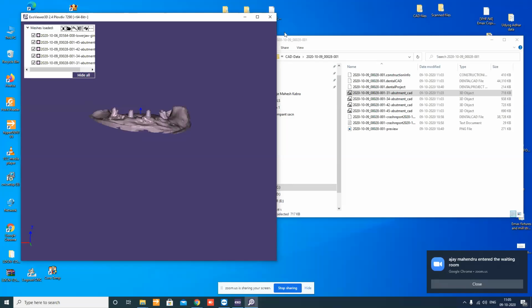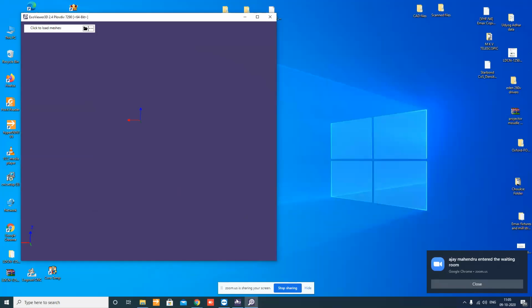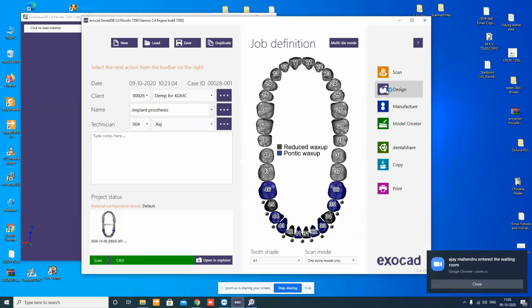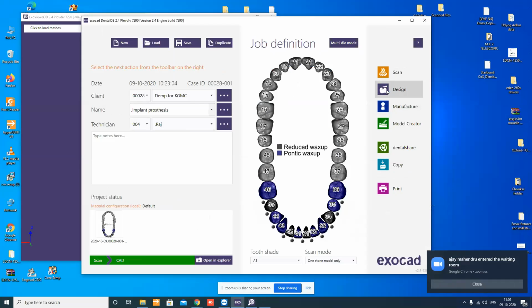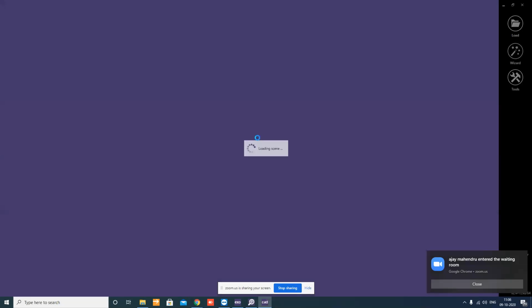Now we go for prosthesis design if necessary. Okay, remove all. We open the order page. We design the prosthesis. Now the prosthesis can be in the form of a reduced metal substructure, a framework for ceramic layering or composite layering. So we quickly design that. We load the scan file, I mean whatever data we have prepared so far, we can continue from there.